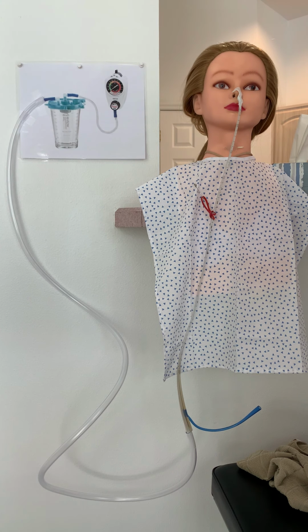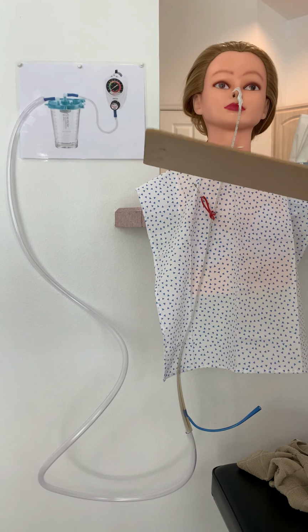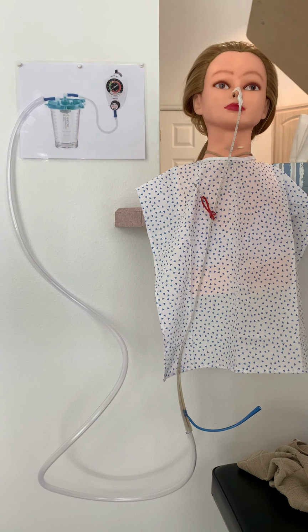Knock on the door. Hi, Mrs. Harper. This is Linda, your nurse. It looks like the doctor wrote an order for us to remove that NG tube. It sounds like you're doing a lot better. I'm so glad. Can you just verify your name and date of birth for me? And I will verify that against the medical record, and it matches. So I'm going to provide for privacy, and I'll close the room door or the curtains.